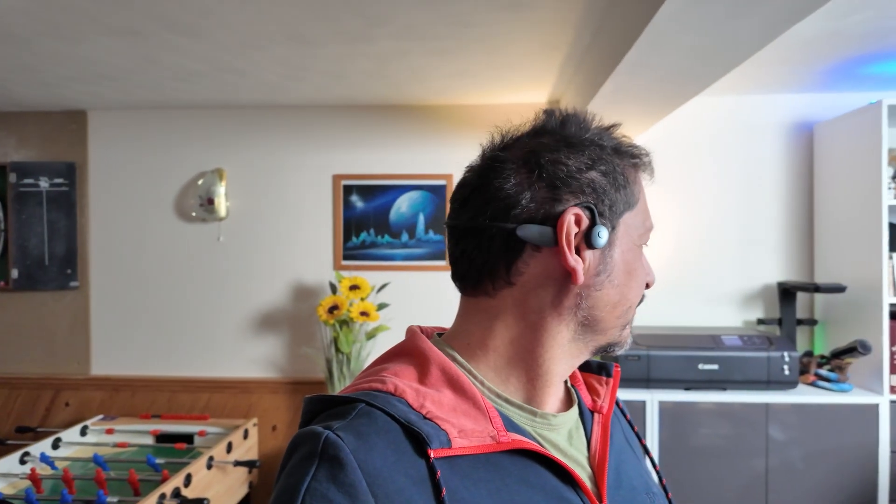Let's pop these on. You can see how they fit — the band goes behind your head at the bottom of the nape of your neck, and the bone conduction pads sit just in front of your ears, almost on your temples. I have to say, these are very comfortable.